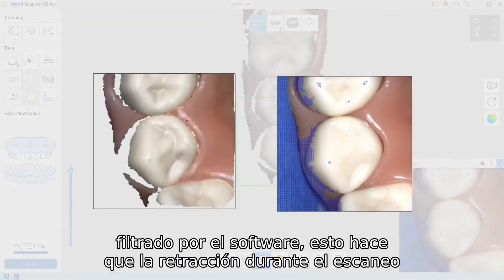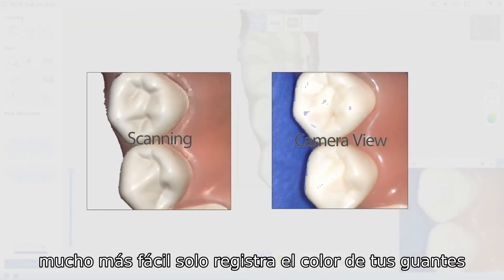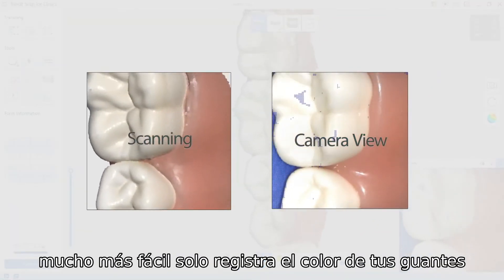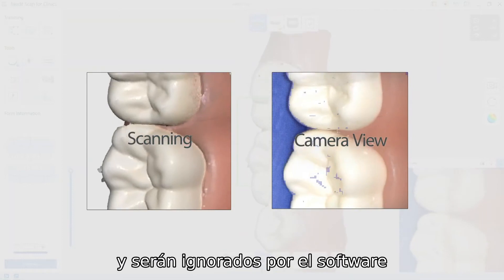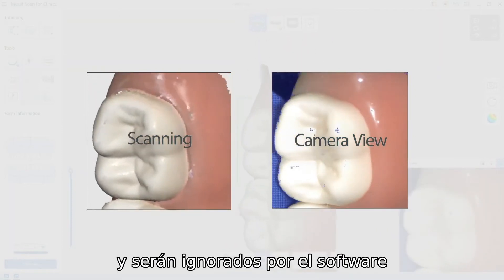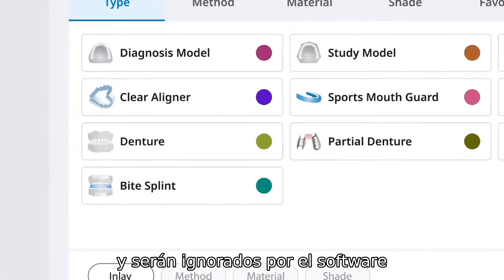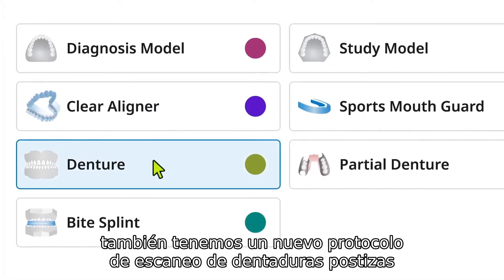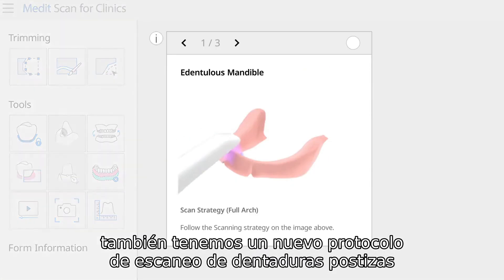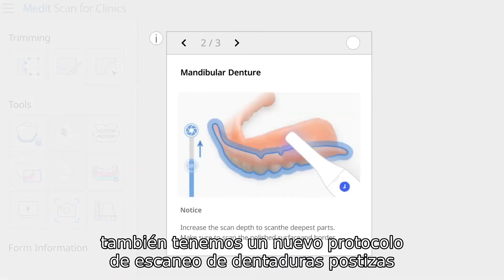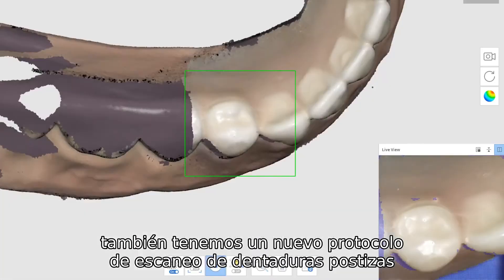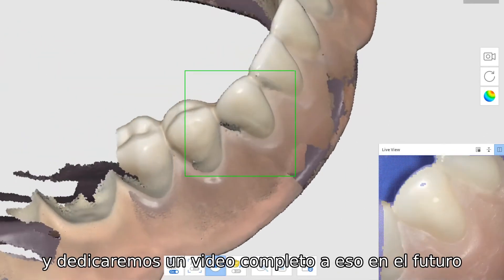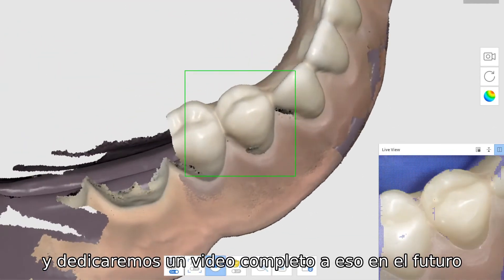This makes retraction during scanning much easier — just register the color of your gloves and they will be ignored by the software. We also have a new Edentulous Denter Scan protocol, and we'll be dedicating an entire video to that in the future.